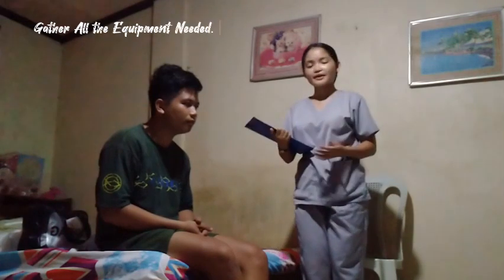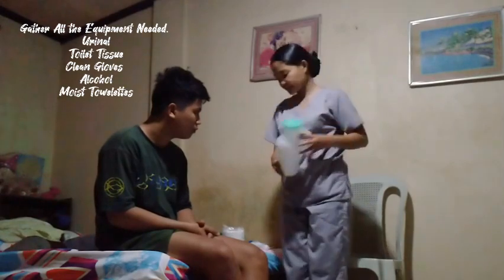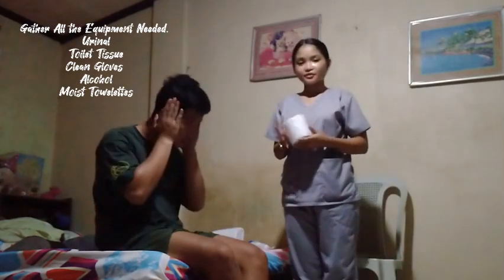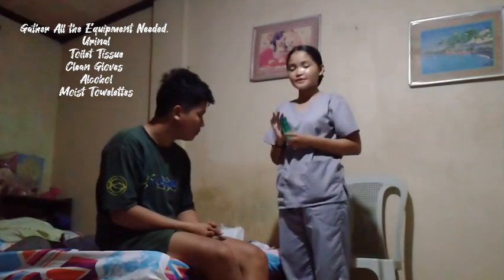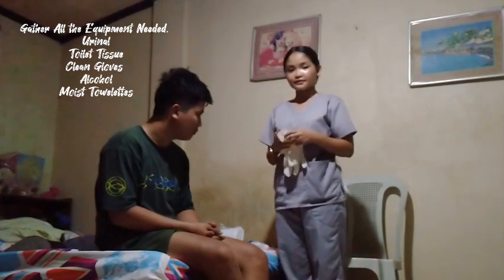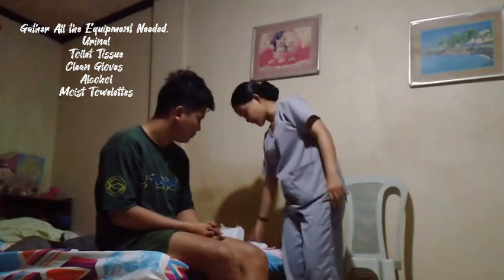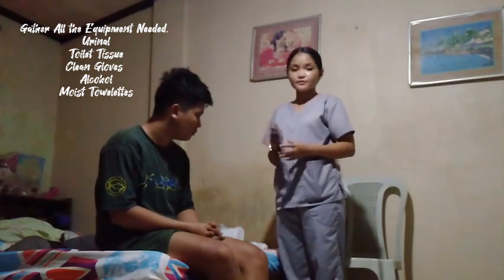So the first thing to do is to review the patient's medical record for limitations of physical activity. Then after that, we are going to gather all the equipment needed. So we are going to use this urinal, a toilet tissue, the hand sanitizer, which is alcohol, and clean gloves. And for the moist towelettes, we are going to use these gauze pads.